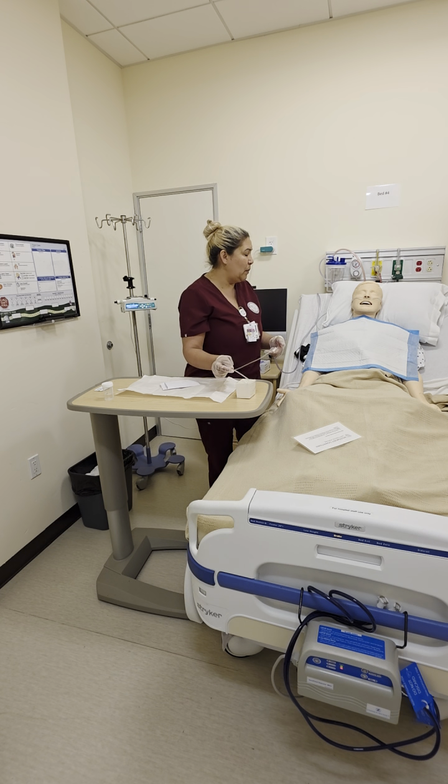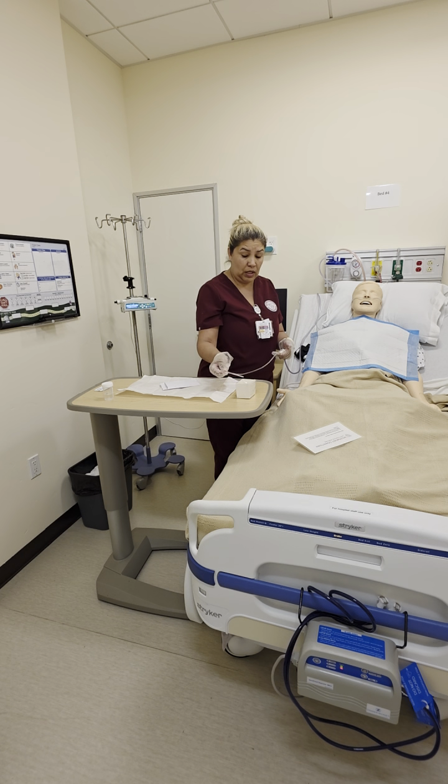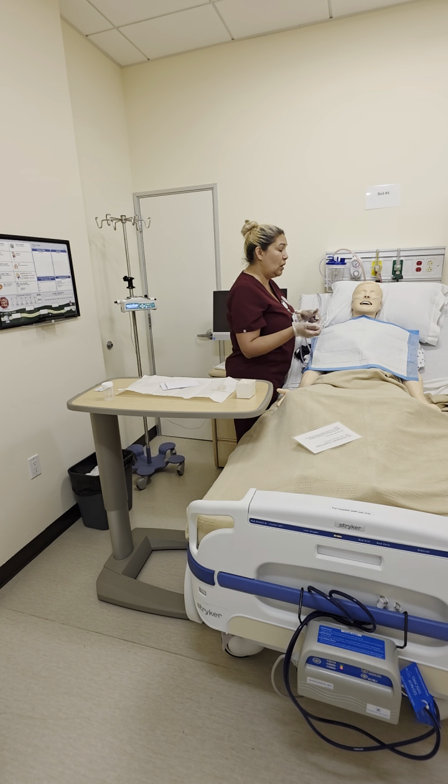I still hear that my patient needs another suctioning. So I will go ahead and perform the procedure again. I've cleaned it out, dip it in jelly. This time I will use the alternate naris, so I don't want to use the same naris. And in between the suctioning, I want to wait 30 to 60 seconds.